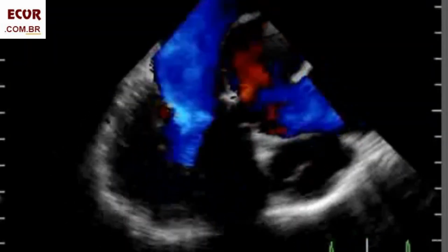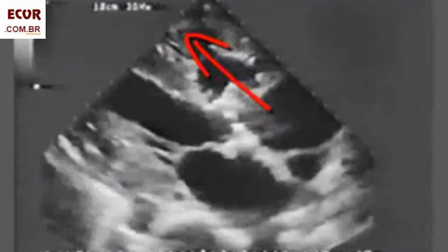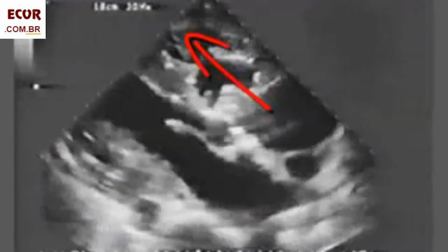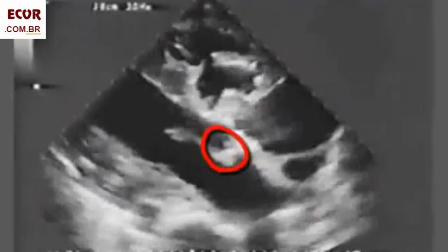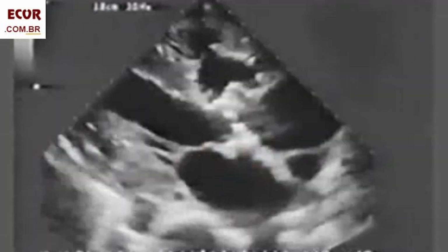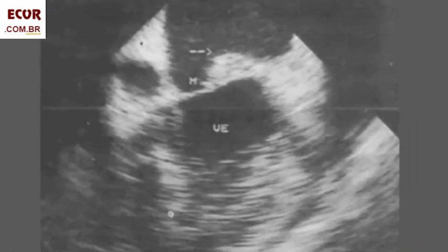One more abscess that emptied in the right ventricular cavity and to the aorta, forming a fistula, aorta, right ventricle, across the abscess. You may notice also here this typical thickening of an early abscess. And what about this here? It's the right pulmonary artery. No abscess.